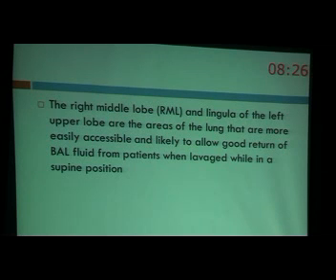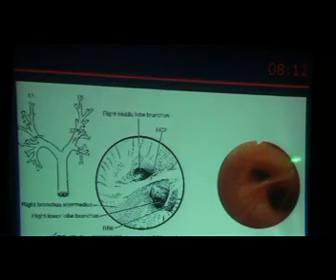دخلت لور لوب وفي اللور لوب ده في انفيزيما او في فايبروزيس او في فار ادفانسد برونكيتاتيك ارياز، هيبقى الريتريفر قليل جدا داون تو 10%. ساعات ما نبقاش عارفين نجيب اكتر من كده. طبعا ده الميدل لوب الناس كلهم اورينتد. دي البي 4 بي 5 دي البي 6 الابيكال سيجمنت اوف ذا لور لوب وده اللور لوب بروبر.